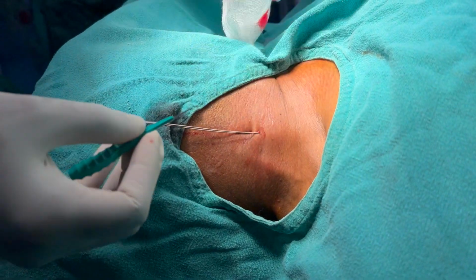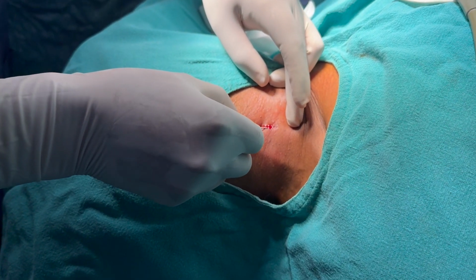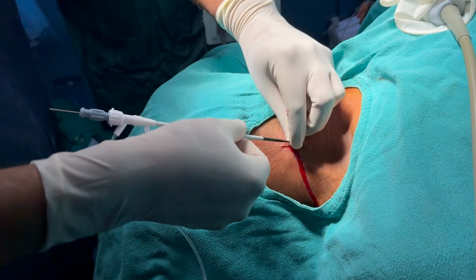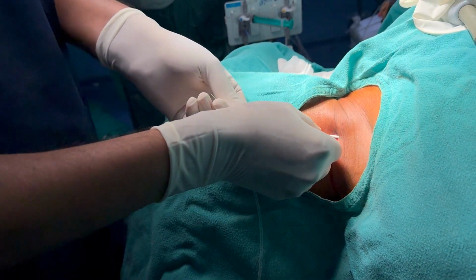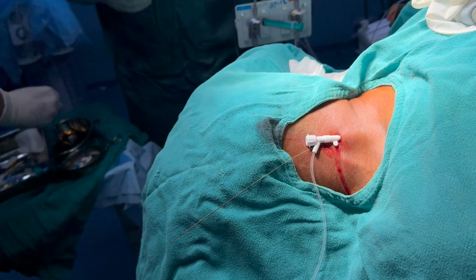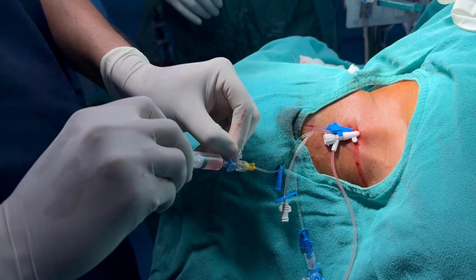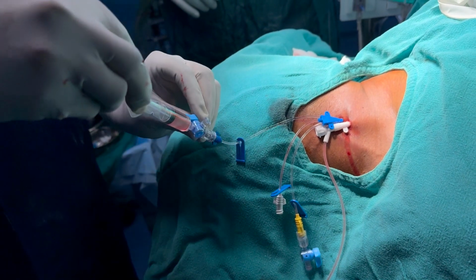So we have to make a small nick over the insertion point. Now we have to insert the introducer set while the dilator is inside the introducer sheath. You have to hold the dilator and guide wire both in the left hand and then push the introducer sheath into the IJV. Here you can see the free flow of the blood, and then you have to insert the CVP line over the second guide wire.